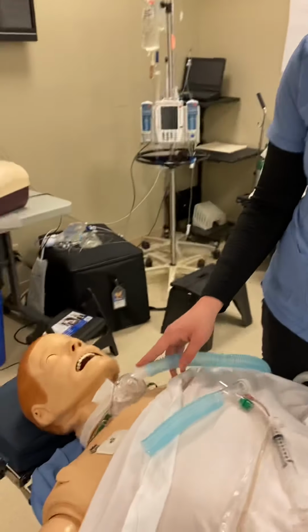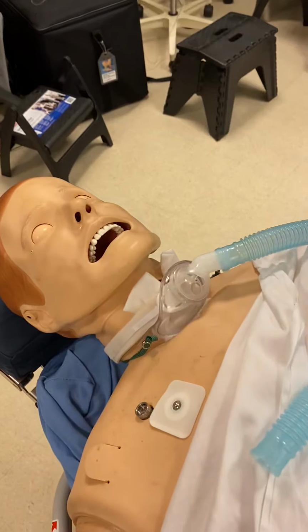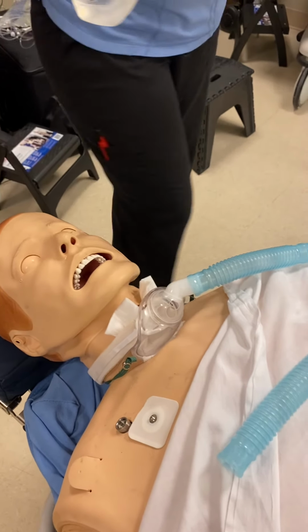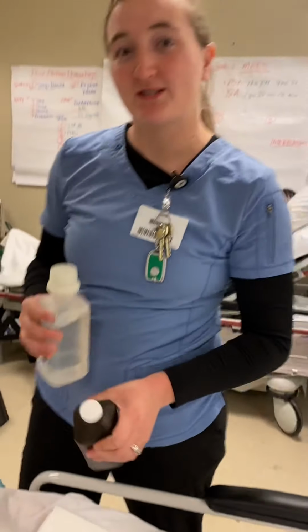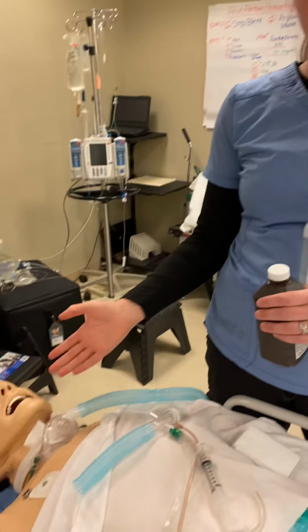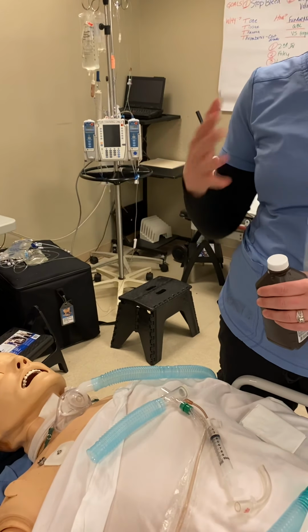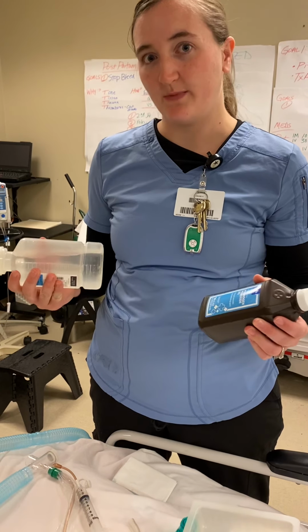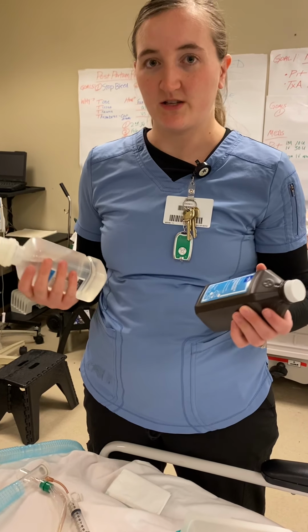You're going to want to make sure you oxygenate your patient while you're prepping and getting things ready. A couple of things that you need. When you oxygenate your patient, you want to make sure that you have oxygen on and their sats are above 90, 95, what they've been. You're giving them 100% oxygen for about 1 to 2 minutes to help them maintain that oxygen level.